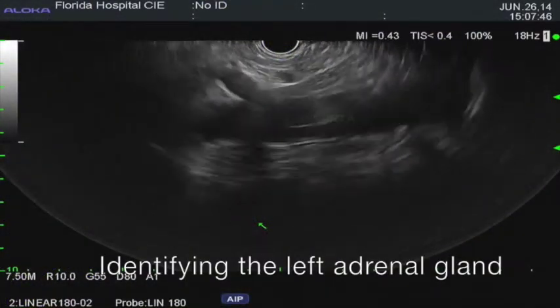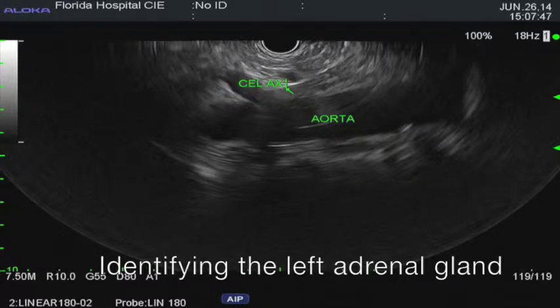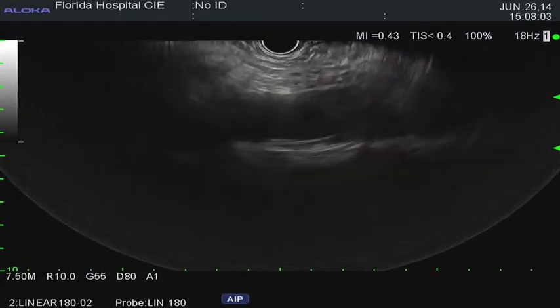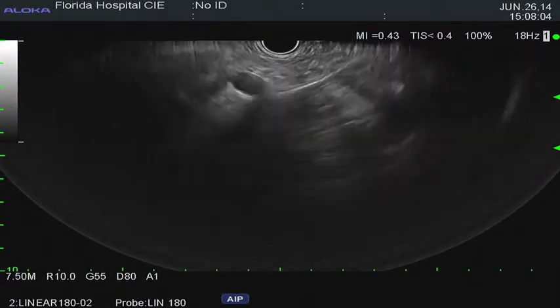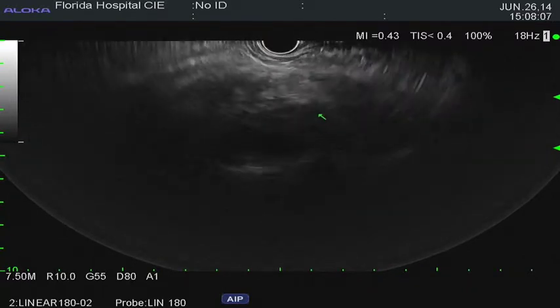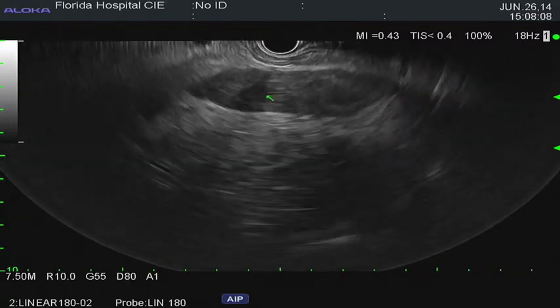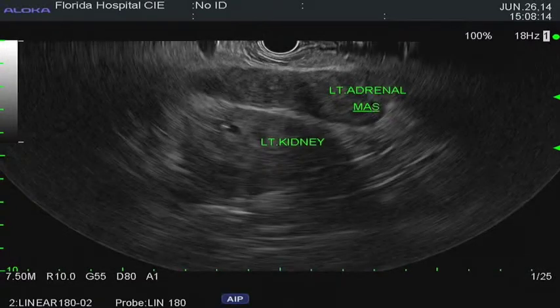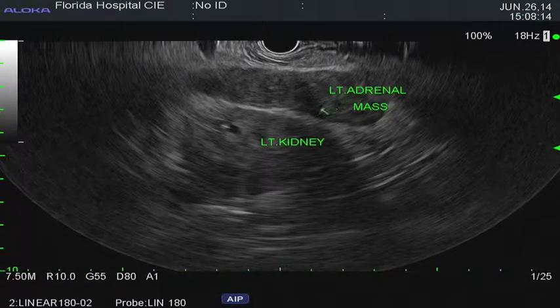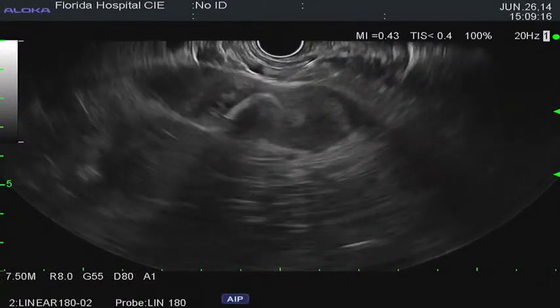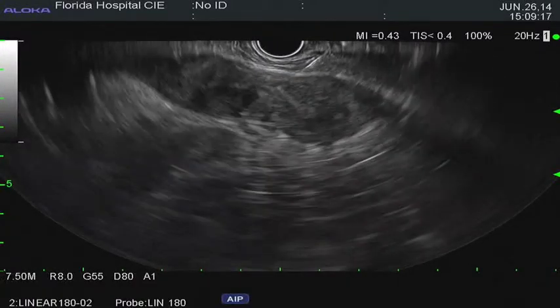The left adrenal gland is found by locating the celiac artery takeoff, following the artery for a couple of centimetres in towards the stomach, then turning the scope clockwise or to the right, bringing the adrenal gland into view. There was a high suspicion of a left adrenal gland metastasis and confirmation by EUS FNA was obtained.